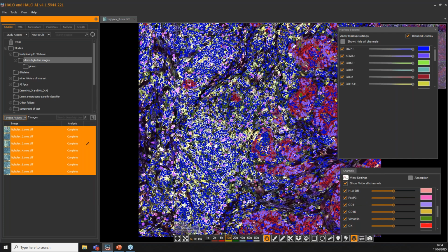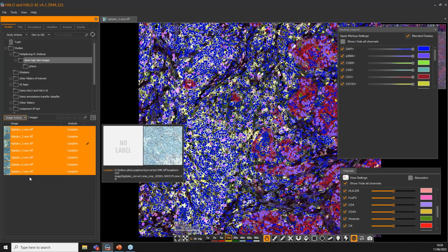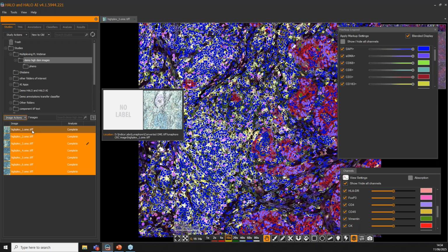But there are other steps that you can do in terms of data exploration. So we have sort of opened a new field of data exploration in Halo, while before we were just focusing on image processing, which is our clustering and dimensionality reduction workflow. So this is accessible at any point now in Halo, as soon as you have some object data from the cell segmentation module.